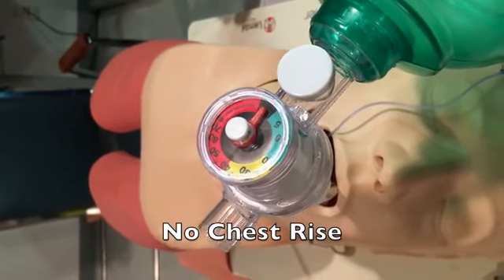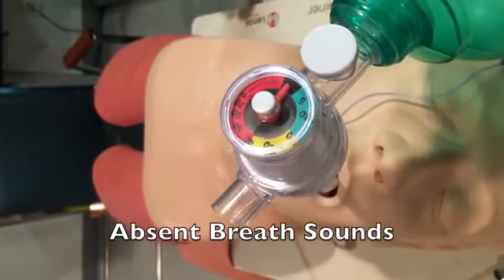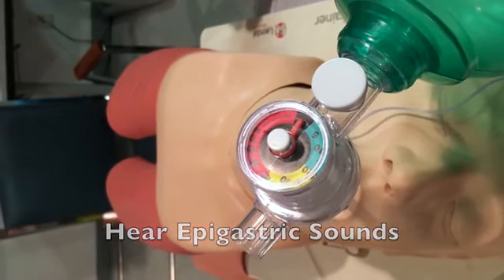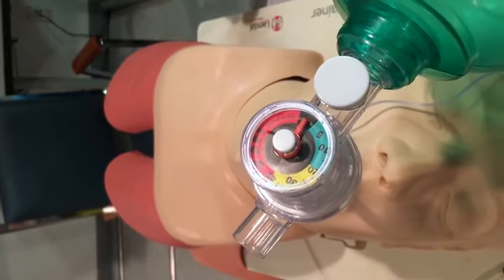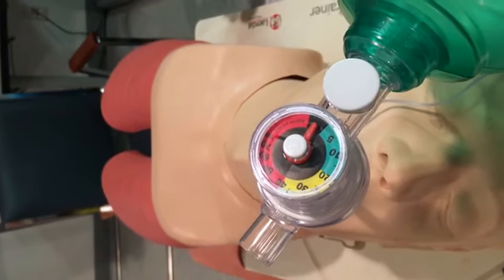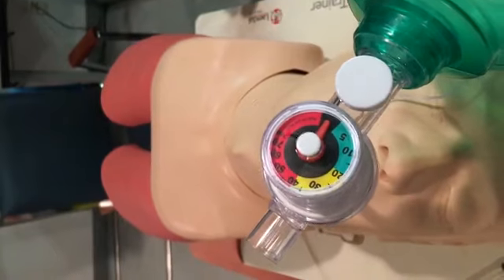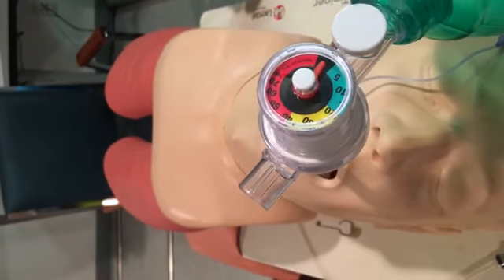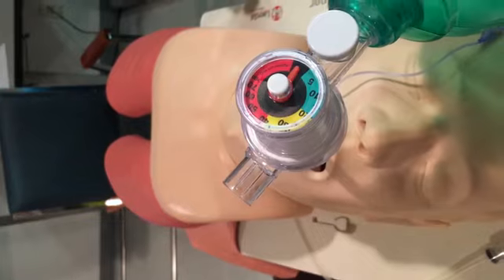There's no chest rise. There's a lack of end-tidal CO2 waveform on the monitor. You don't have bilateral breath sounds. And if you auscultate, you hear epigastric sounds over the stomach. So you definitely want to remove and discard the ET tube, and then make sure you establish adequate bag mask ventilation. You can use adjuncts for effective bag mask ventilation, like an oral airway, if you used it prior to attempting to intubate the patient. So this is another thing that can happen when you think you intubated, but you actually intubated into the esophagus.